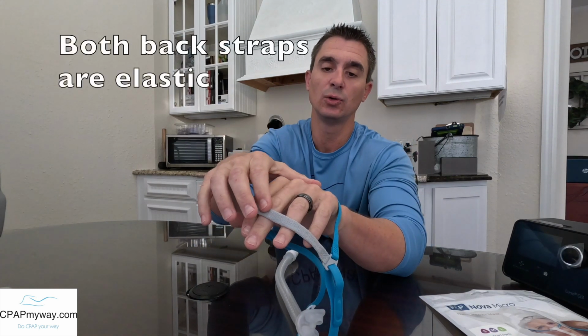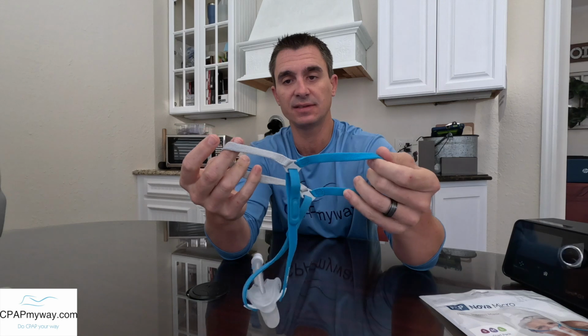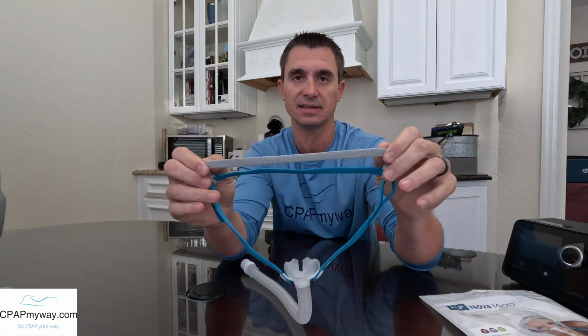Let's talk about the headgear a little bit. My opinion on the headgear. This is a bit unique, especially for any of the major brands, Fisher, ResMed, or Respironics: that top-down adjustment and two elastic head straps. A couple things about that. I think these eventually will wear out like any elastic does. Once this elasticity wears out, you will be able to adjust it from here, but eventually it's going to loosen up on the top of your head, and it's probably going to have a different fit, in my opinion. It does have the adjustments, which is nice, so as they start to stretch out, you'll be able to tighten it up a little bit, but I think it will probably get a little bit annoying once those things wear out.